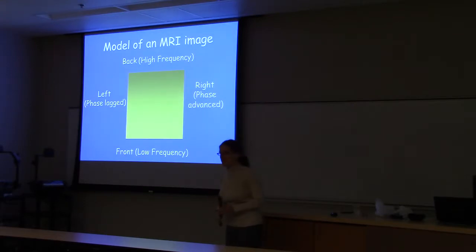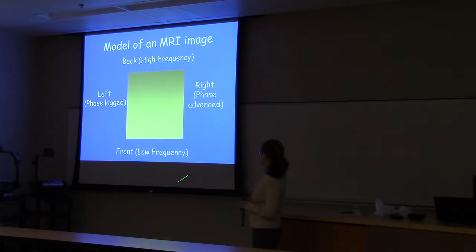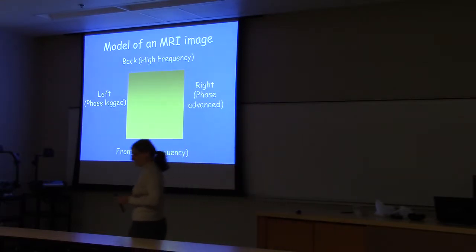So I'm going to have you guys pretend to be hydrogen nuclei, and I'm going to take an image of this room. I'm going to put on a magnetic field gradient. It's going to be slightly lower magnetic field at the front of the room, slightly higher at the back. And I'm going to come by and play a note, and so those at the front of the room are going to get a lower note, those in the middle will get something in between, and those at the back, since I don't like people sitting at the back, I'm going to give you a really high one. So here I come. I'm going to play it, and you guys come along.